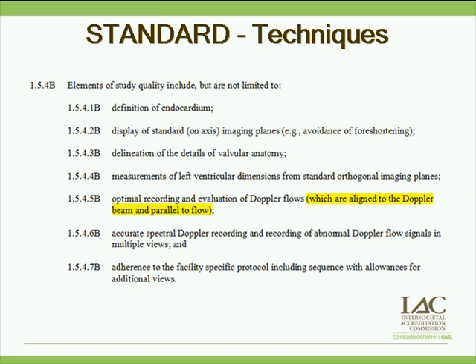The other one that we see, and I'm going to talk more about it in a few minutes, is using that dedicated CW probe from multiple views. For an AS patient, you have to use multiple views, not just use your apical view with your imaging probe and then take your dedicated CW probe and put it down at the apex again and get another signal. That just doesn't do it. You don't know how that flow is directed.